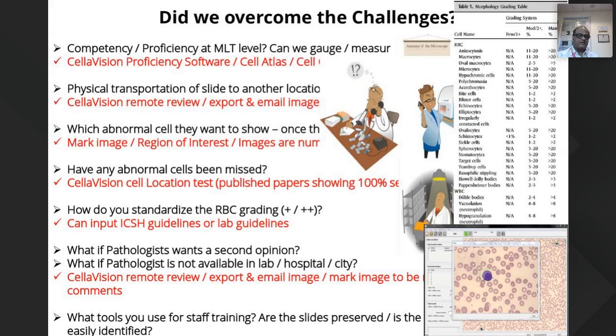Do we have the capability to miss abnormal cells? No, because it has 100% sensitivity in blast cells. And we have to understand that before you put these machines into use, you have to take at least 50 abnormal slides, do the verification with manual microscopy with 2 observers, and then with the digital imaging itself.